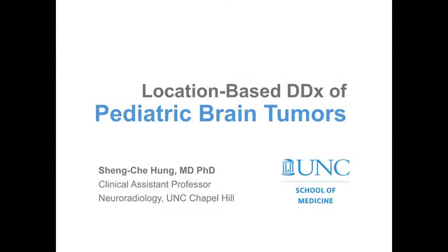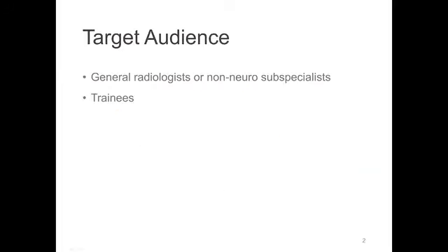Okay, thank you for having me here. Today my talk is going to be about the location-based differential diagnosis of pediatric brain tumors. The target audience of my lecture is mainly general radiologists or non-neuro specialists who might not be very familiar with pediatric brain imaging, but still occasionally need to read those studies. I hope my talk will also be very helpful for trainees.